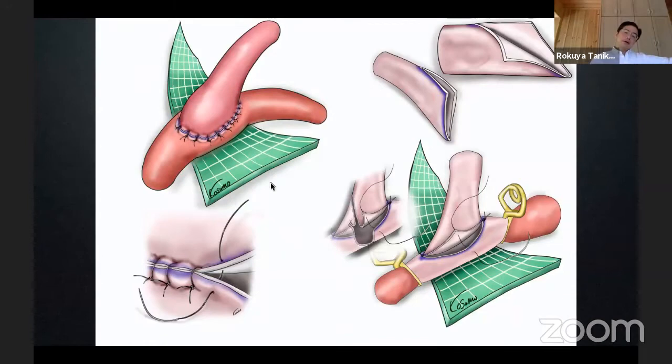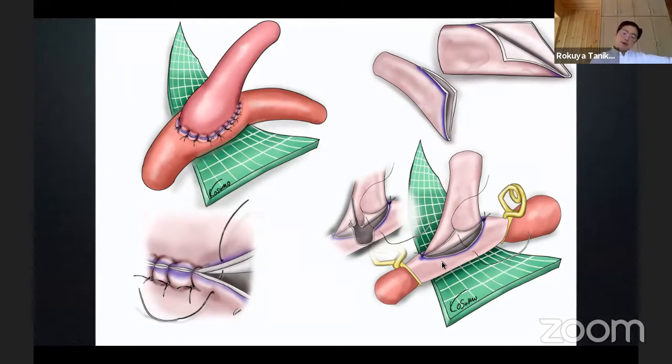This is the final view of anastomosis. After the stay suture, the intermediate stay suture in the middle of the arteriotomy helps to stitch the vessel wall easily with the fish-mouth trimming.